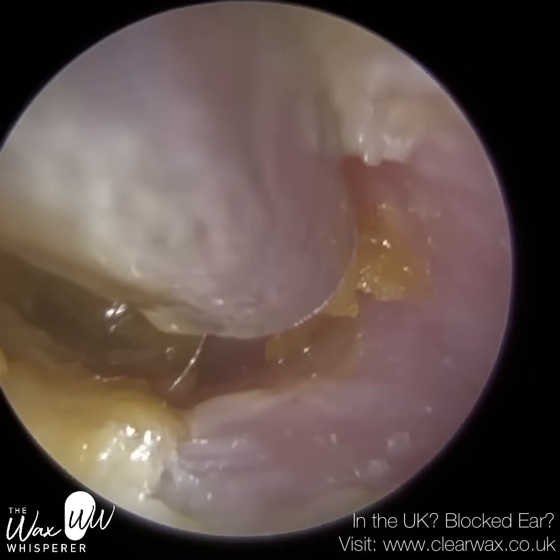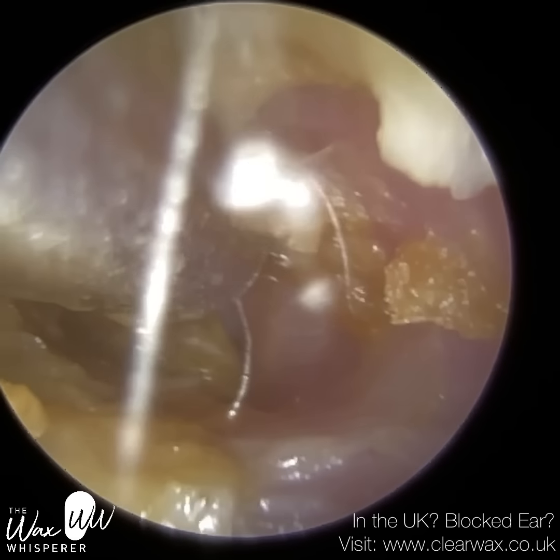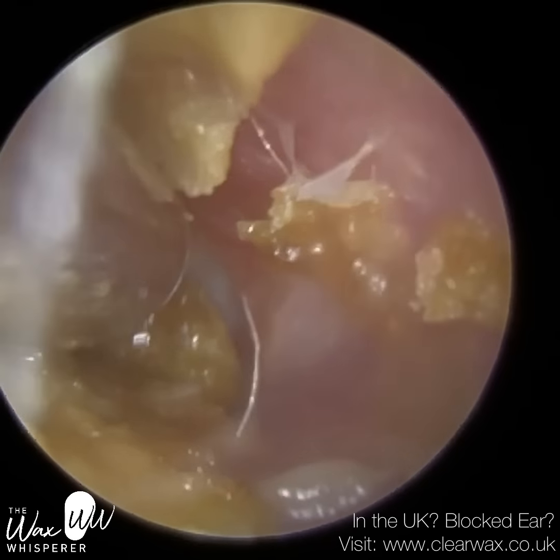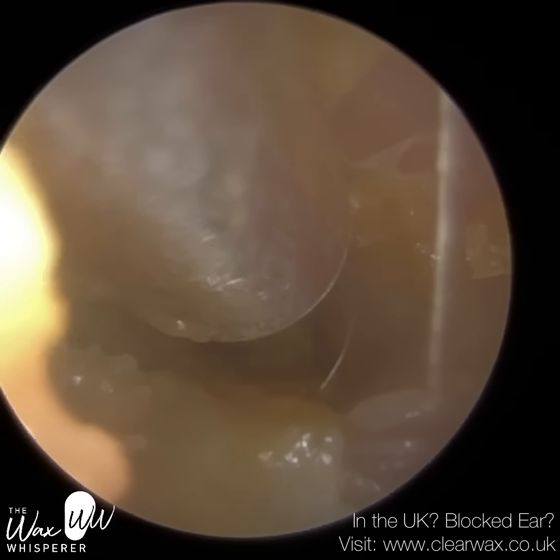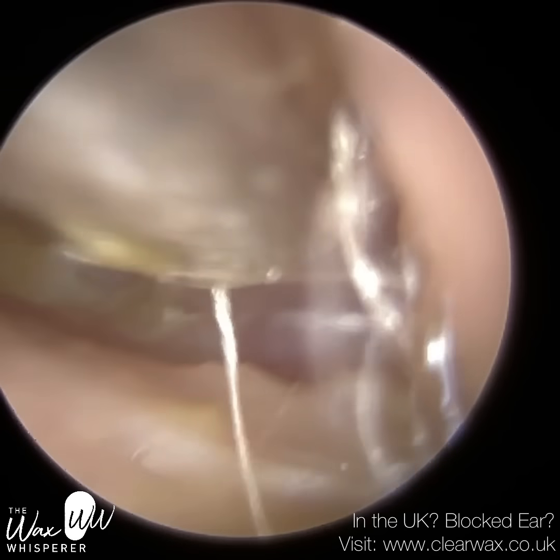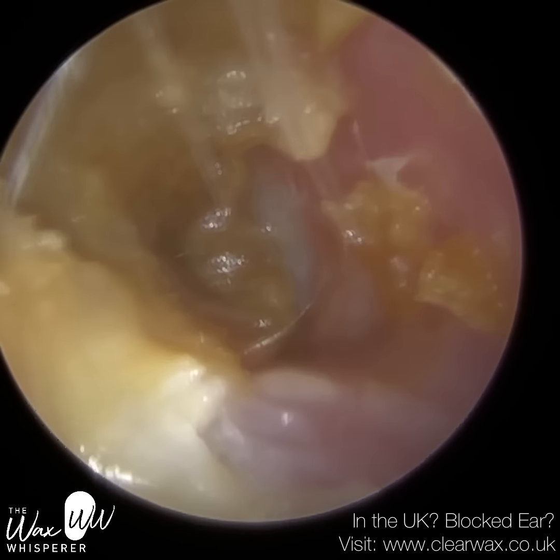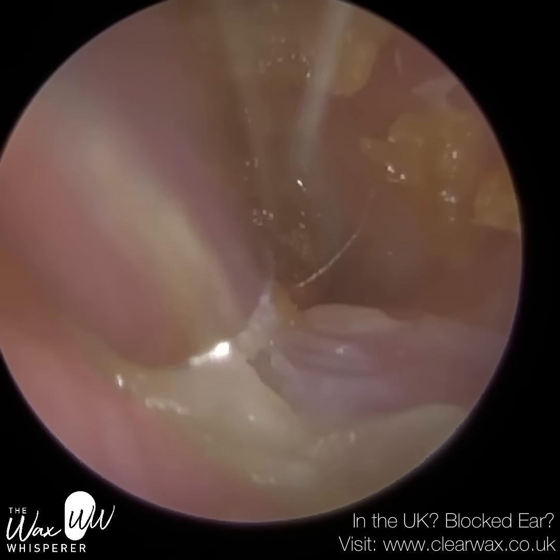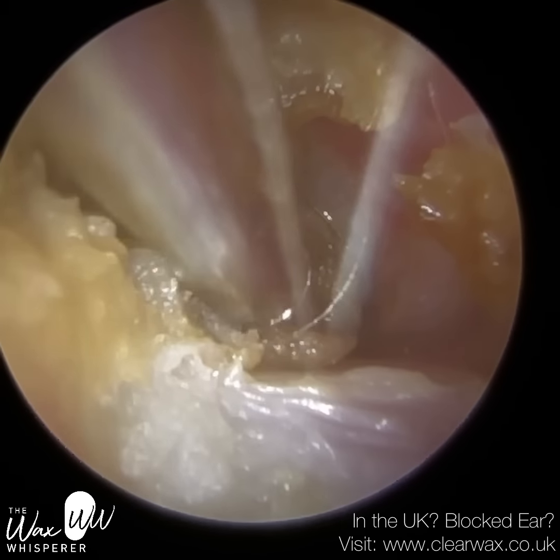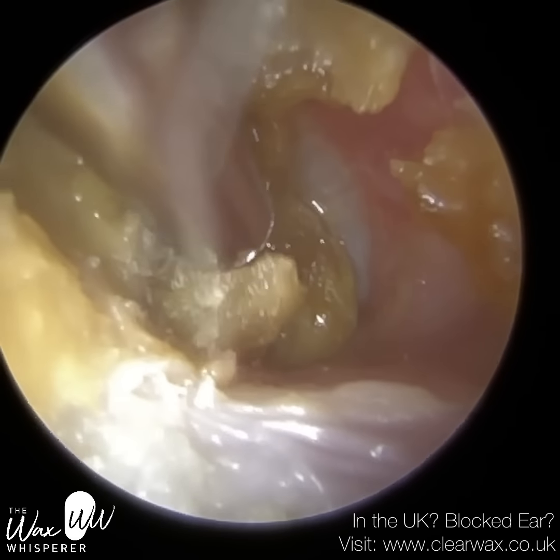The ear canal is slightly inclined — it's not a straight horizontal tube. You've got these bends and twists, and it's kind of upward sloping at about a 32 degree angle. So by pulling the ear back and up — in the case of the left ear, pulling to the right and then up — you're not only stretching but also straightening the ear canal, and that gives me access to insert the instrument. Otherwise, the ear canal entrance is completely shut. I've managed to remove more of the lateral wax and this dead mushy skin.